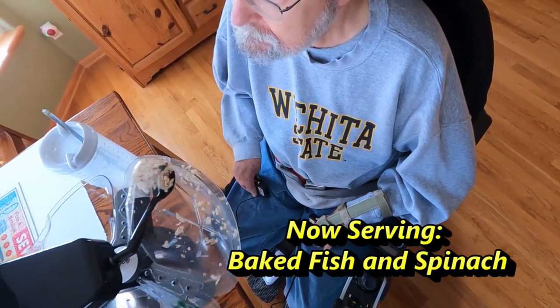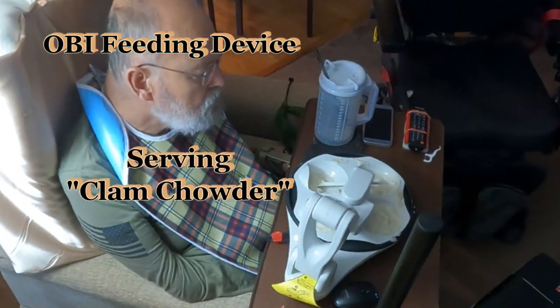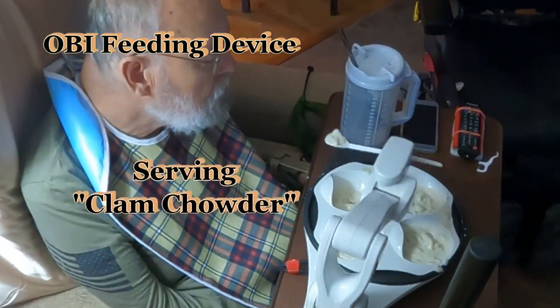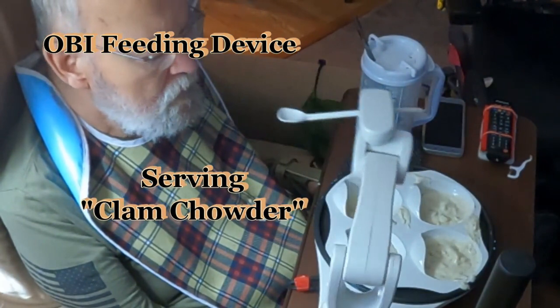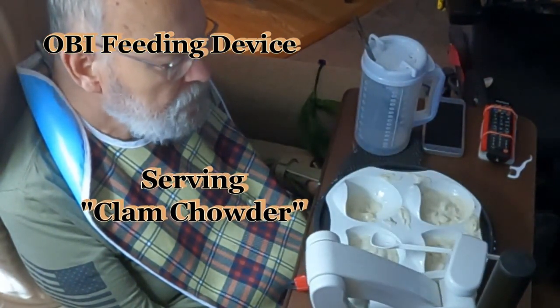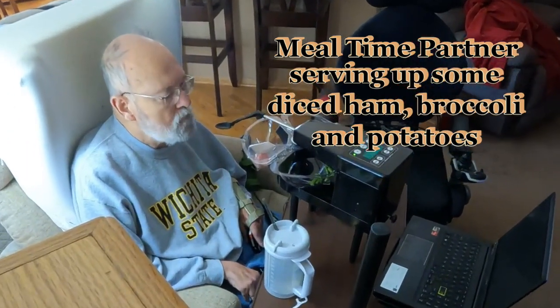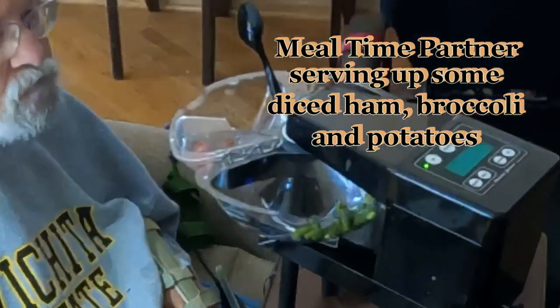That's a quick review of a few robotic feeding devices shown being used by me, a Deep Stage 3 IBMer. The Obi operated as advertised with grace and dignity. My spouse appreciated the help it provided, and bib cleaning was at a minimum. The Mealtime Partner seemed so much larger than required and had so many pieces to clean and store between uses.